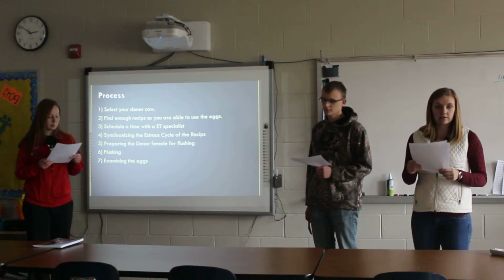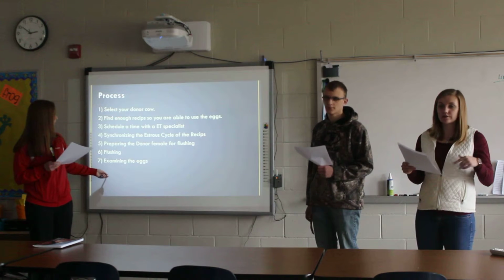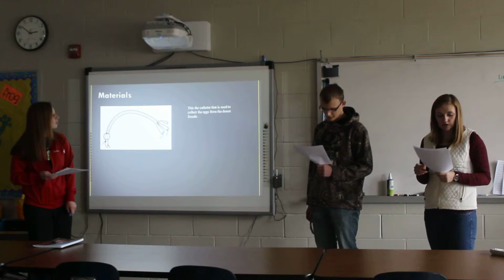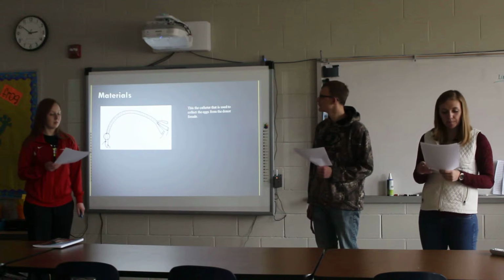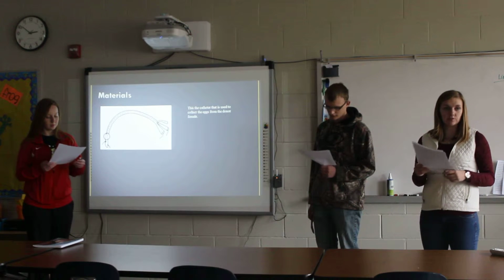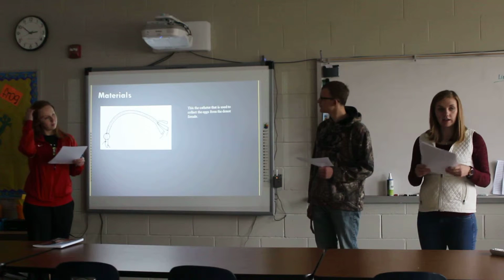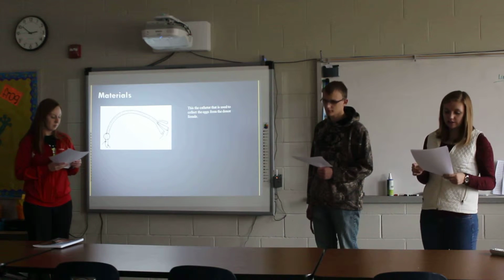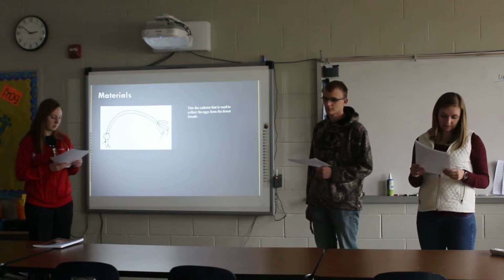Embryos are microscopic, usually about 0.2 millimeters in size. So only undamaged embryos at proper maturity should be transferred. Embryos should be transferred as soon as possible after the flush, within 8 hours at least. Embryos can also be frozen for later implantation and stored in liquid nitrogen tanks.